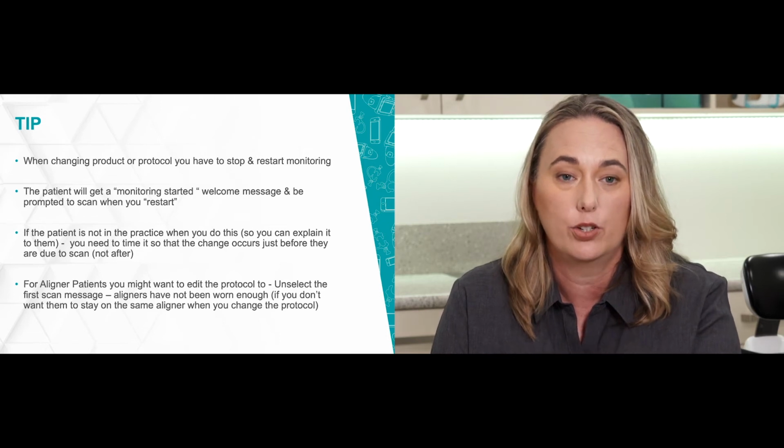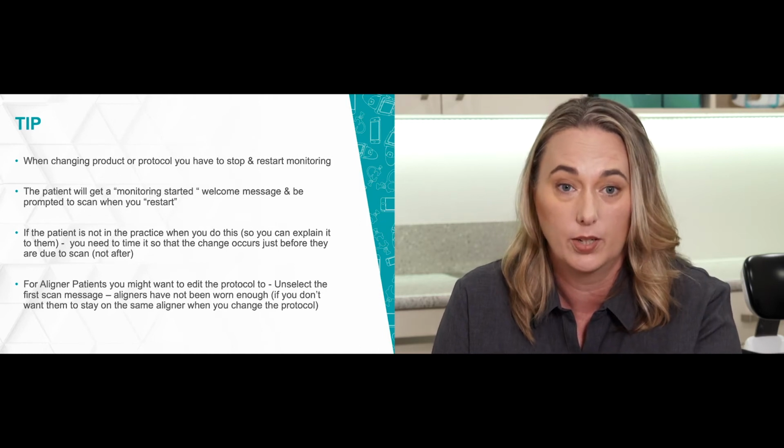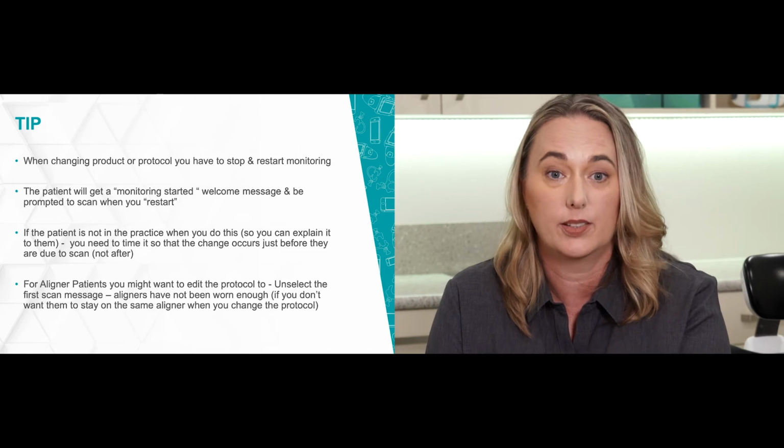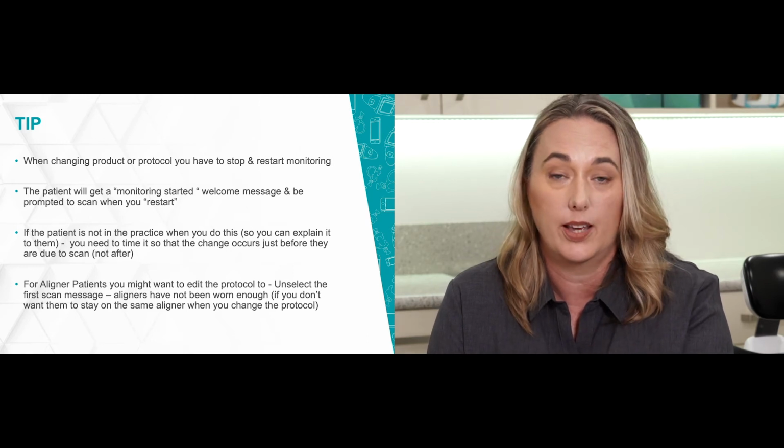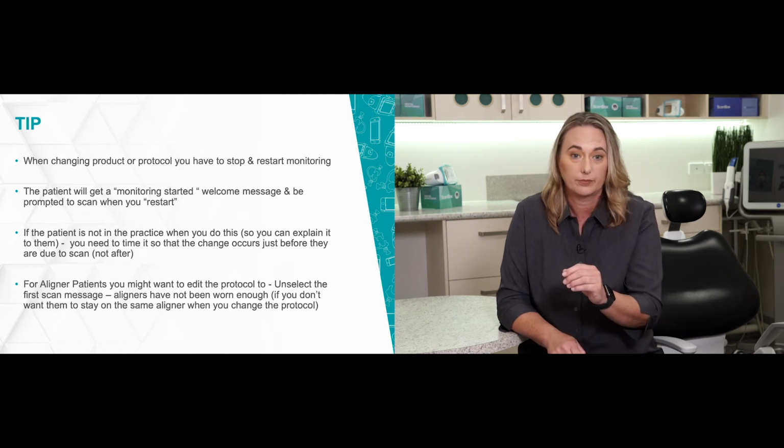And the timing that you choose to do this is really important. If the patient is not in the practice when you do this, so you can explain it to them, you need to time this stop and start just before they're due to scan, because if you do it after they've scanned and then they get another message to scan, you're just going to annoy the patient.